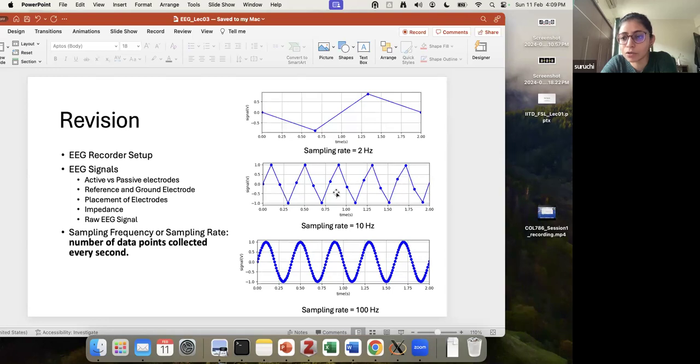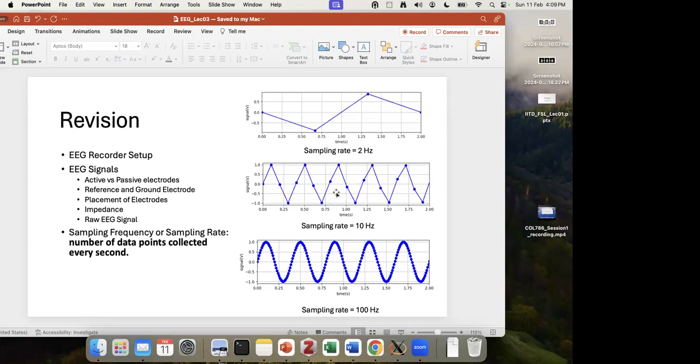In 2 seconds it was done 4 times, so in 1 second twice. Yes, ma'am. So your sampling rate becomes 2 hertz.